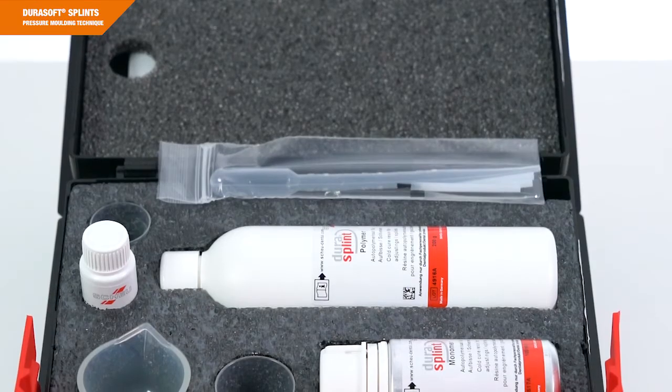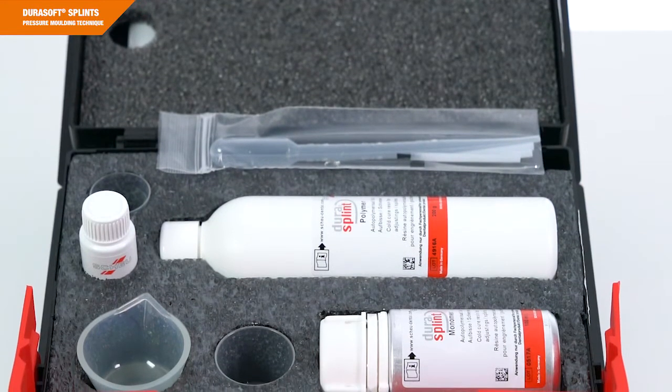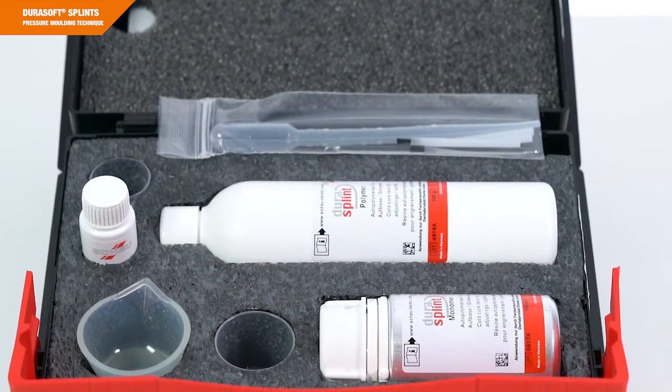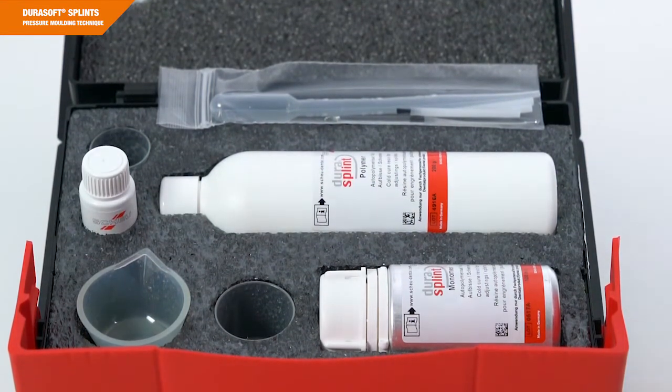If you intend to fabricate an occlusal splint with adjustment, you can build up the thermoformed splint with DuraSplint. DuraSplint is a cold-cure resin that combines very well with the thermoformed material. It is manufactured on the basis of methyl methacrylate and is cadmium-free. It is characterized by simple mixing, controlled modeling, excellent stability, long working time, and good polishing qualities.